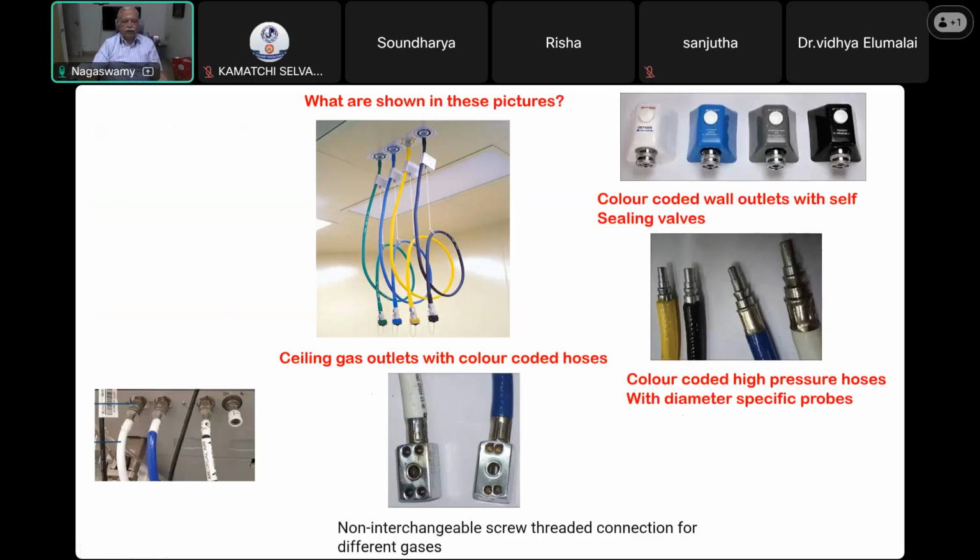Mostly you won't be seeing it in your day-to-day because this is to be connected to other machines. Where is it connected? It is attached to the back of the machine. So this is how the machines are connected on the back side.